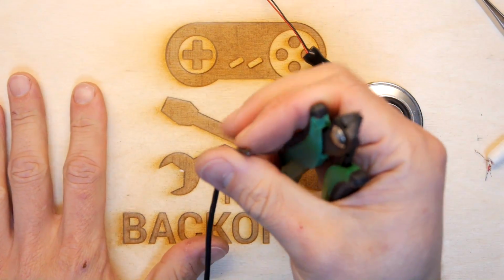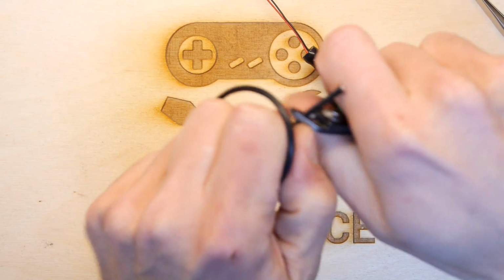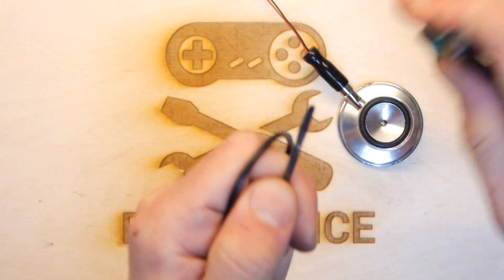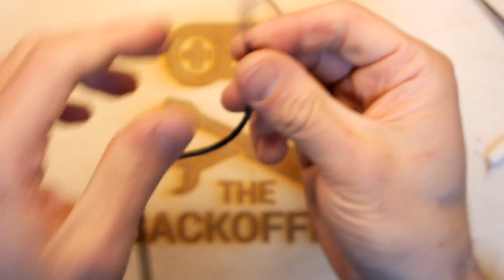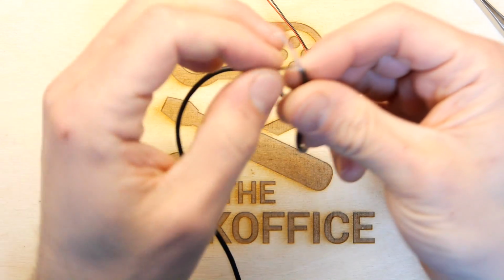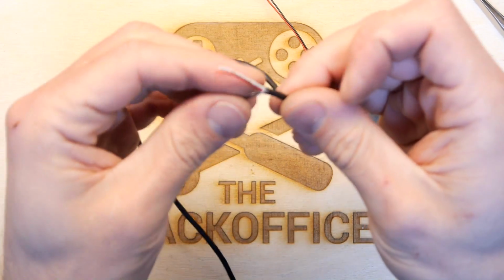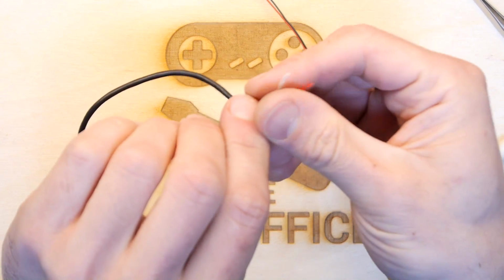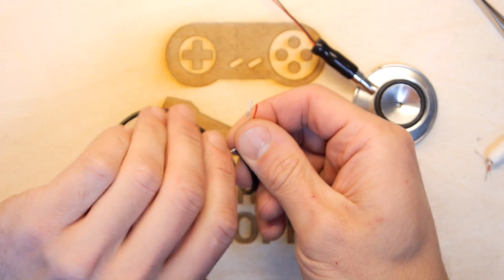And we're going to just take the ends of this. Should be a couple of cores. And there they are. So you can see you've got a red wire and a white wire. So those two represent the two channels, left and right. I'm just going to twist them.